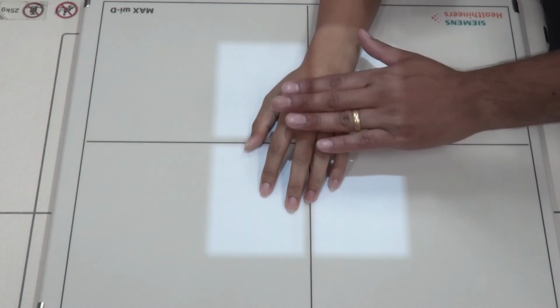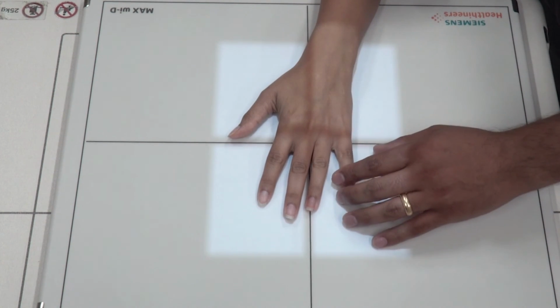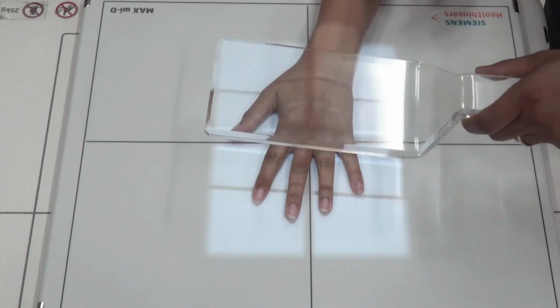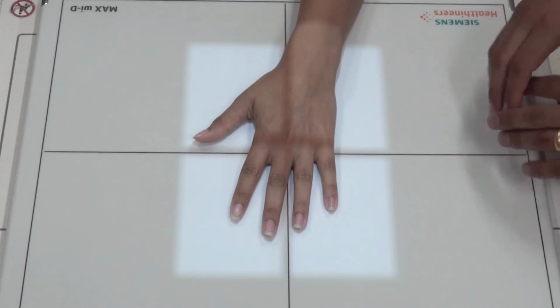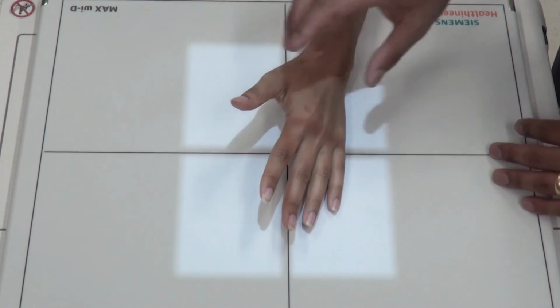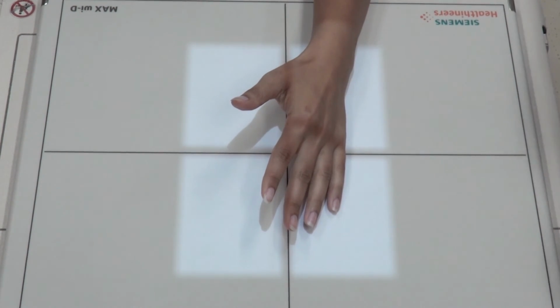One is to press on the hand as much as possible to get it completely flat, and then spread the fingers slightly. And the second way is to use our hand spatula and just press down on the hand. So going from a PA position, you want to rotate the hand about 45 degrees off of the detector. The digits still should be separated slightly, and you want to ensure the digits are straight and not curled. So this allows the joint spaces to open up.